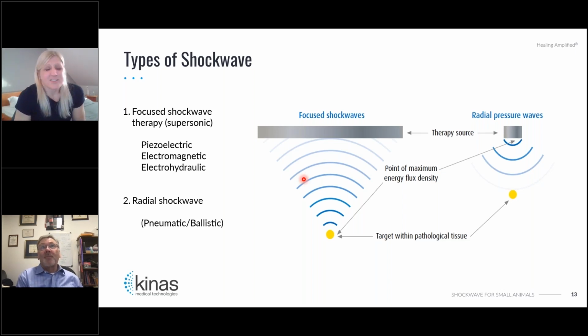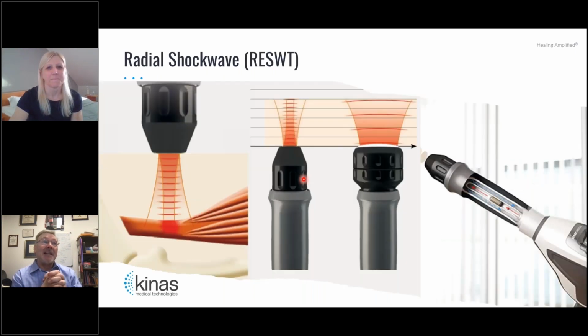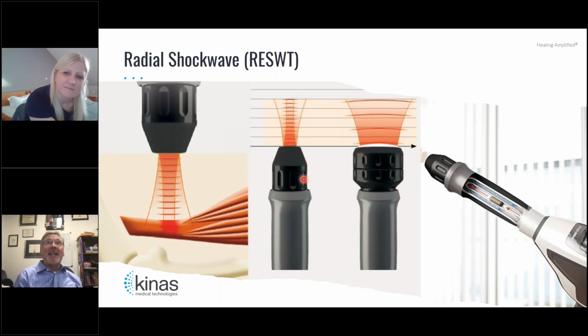Sometimes I just get asked if it hammers out the plate or the implant, and we'll tell you that won't happen, or it hasn't happened in my clinic, and I haven't heard about it. There's really no hammering. The machine kind of sounds like it, and I think that's where people get that idea. But I've done radial and focused, putting it right on the tissue, perpendicular, with a diagnostic ultrasound to see, and there's hardly any motion. So it's more of a cellular effect than some hammering, even though it sounds like it. You see very little disruption of tissue in real time on diagnostic ultrasound.